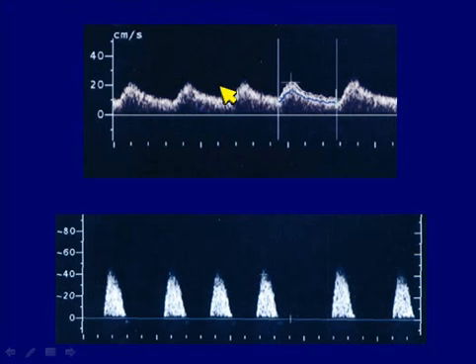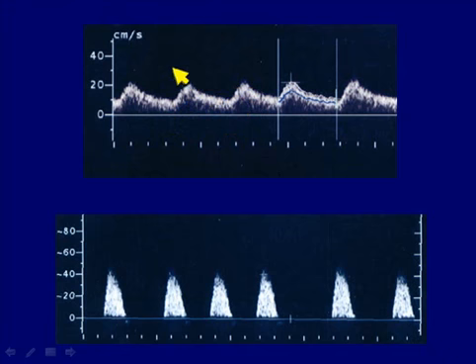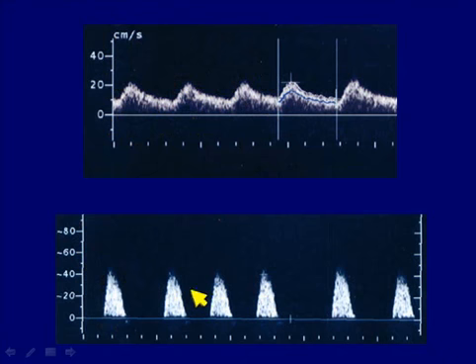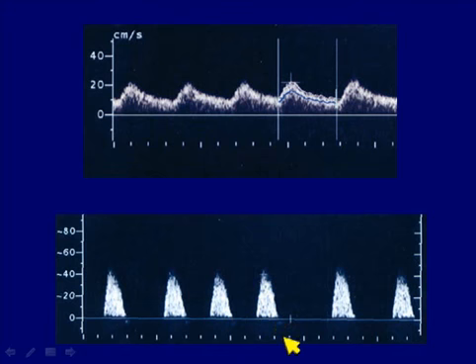We don't want to see these patterns. Here there's a lot of diastolic flow, but the waveform itself is prolonged and rounded — a tardus-parvus-like waveform. It's delayed, telling us right away that this blood has moved through a stenosis somewhere, lost energy, and dampened out. You don't even need to know the velocities; just looking at the waveform, you can say it's abnormal. Similarly, down here we have just one component — this monophasic pattern in systole, no reverse flow, no reflected wave, no antegrade flow through end of diastole. This is an abnormal signal observed proximal to a high-grade stenosis.